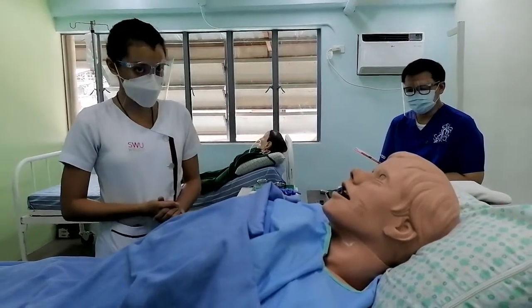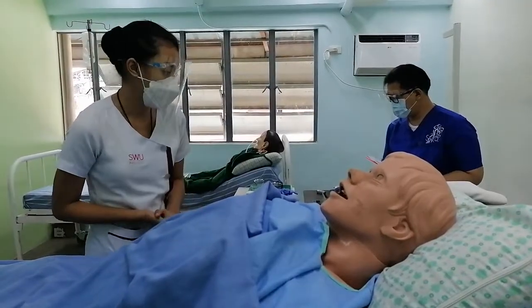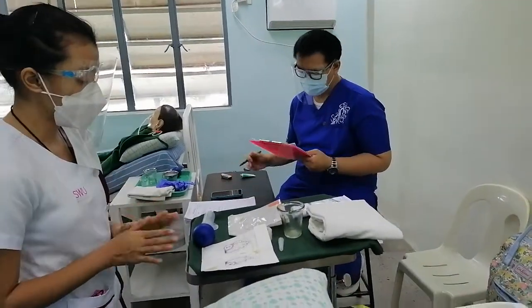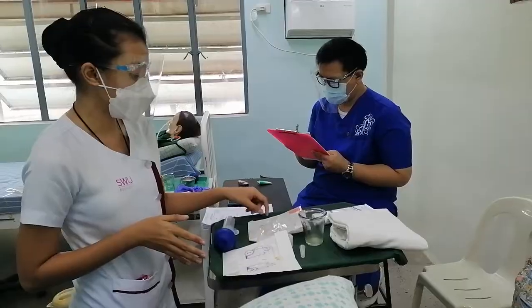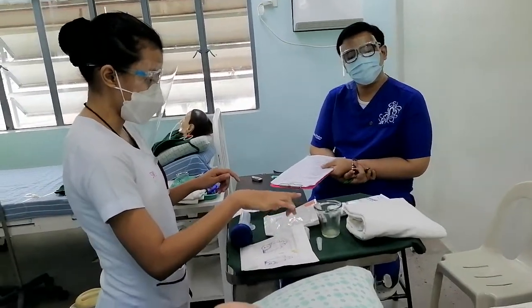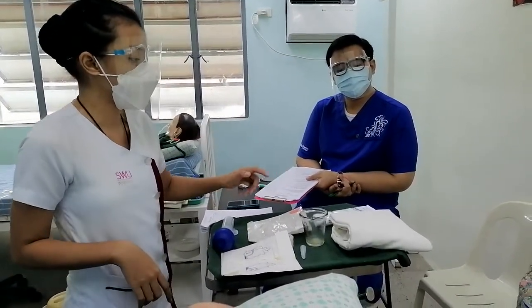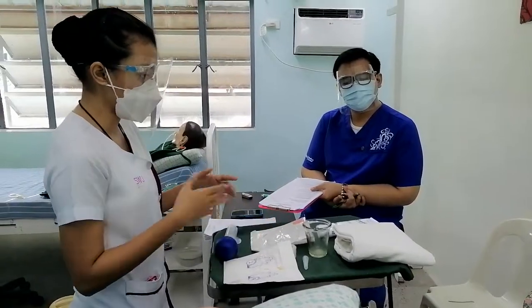After doing that, I will prepare all the materials. The materials being used are: first, the sterile gloves, the asepto syringe, the NGT set, the Leukoplast, the cup, the K-Y jelly or the water-soluble lubricating jelly, and then the towel for the patient's chest.